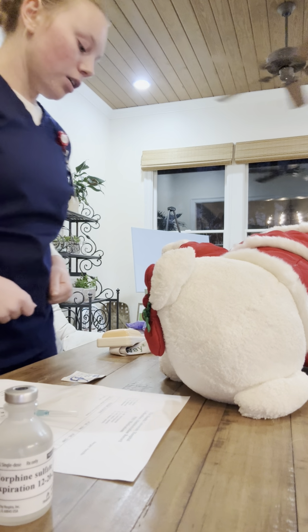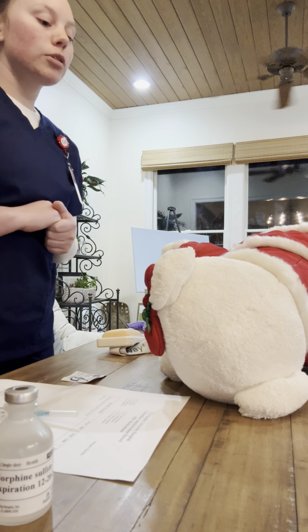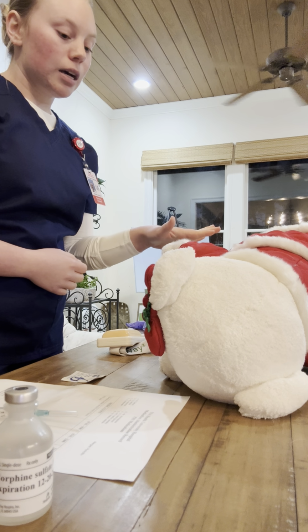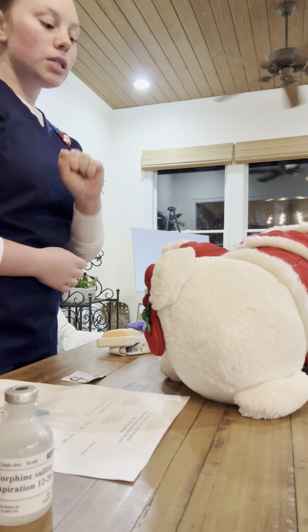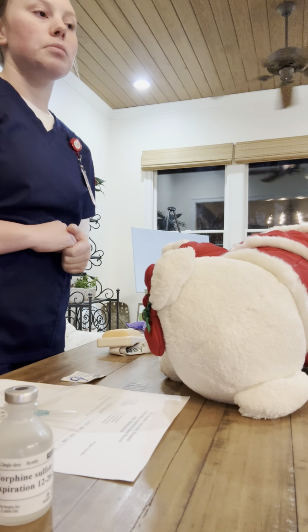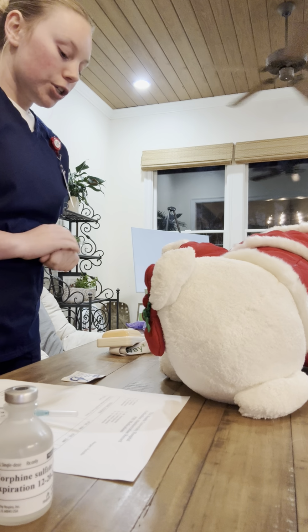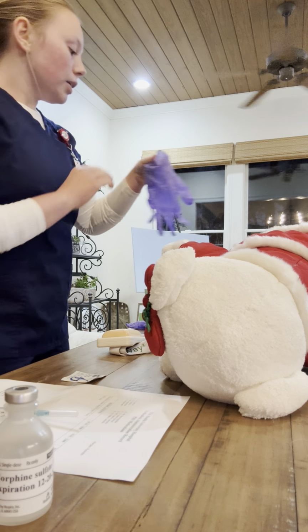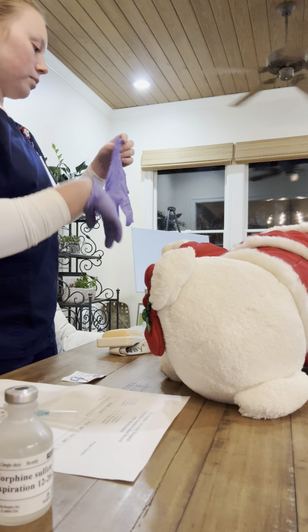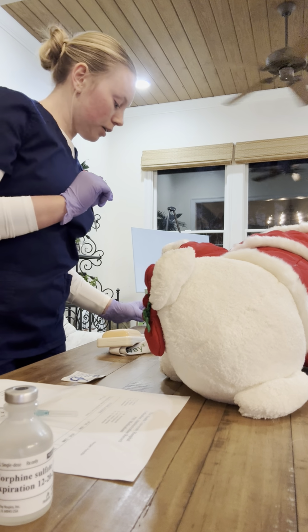Perfect. All right, so the first thing that I want to do is just assess the patient. I would check vital signs, heart rate, blood pressure. I would assess the area that I'm going to be injecting for bruises, blistering, any lumps underneath the skin. If any of that was there, I would just select a different site. So now that you're positioned comfortably and I've explained the procedure to you, I'm going to don my clean gloves. And I'm going to put on my goggles.